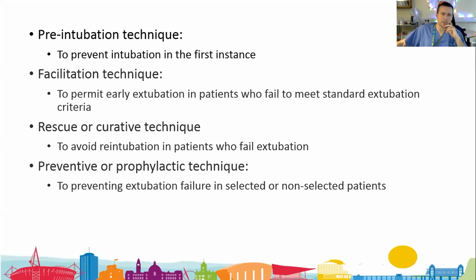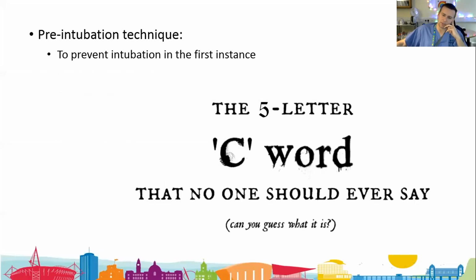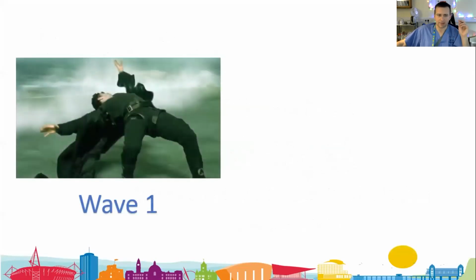We've obviously seen it used in a lot of other areas since then, for example as a pre-intubation technique. And I promised myself I wasn't going to mention the COVID word for an afternoon, but I've blown it within about 3 minutes. There has been a wealth of papers coming out over the last 12 months looking at the use of high flow in this COVID population. The one thing I've got to say is these are mainly retrospective studies, where they've looked back at patients that have been on high flow. The only prospective study going on at the moment is the RECOVERY-RS study, which I'll touch on at the end.